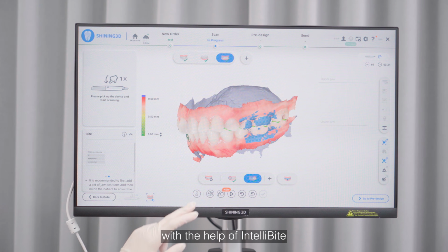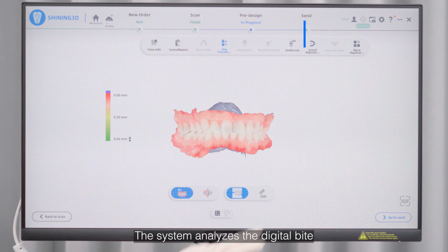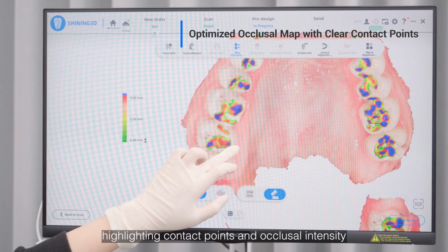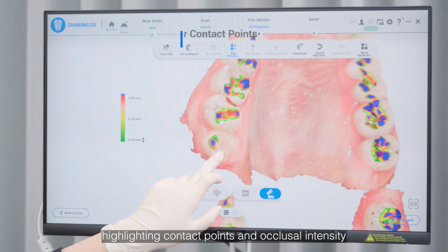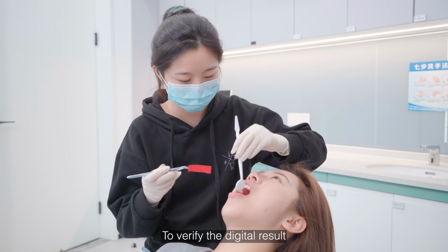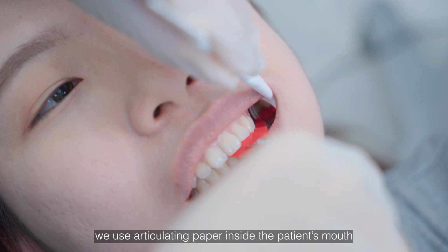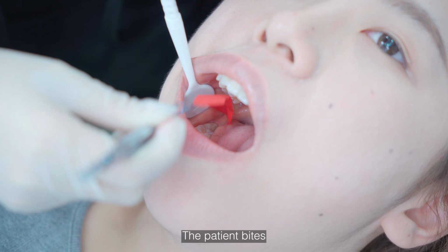With the help of IntelliBite, the system analyzes the digital bite and presents an optimized occlusal map, highlighting contact points and occlusal intensity. To verify the digital results, we use articulating paper inside the patient's mouth. The patient bites.